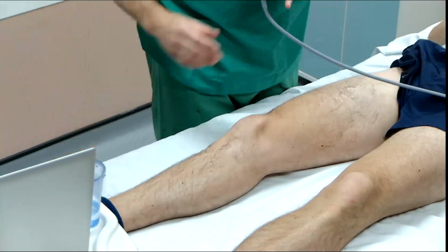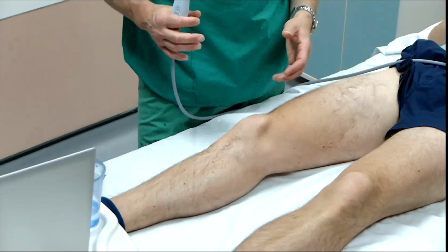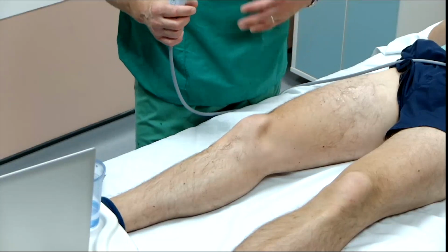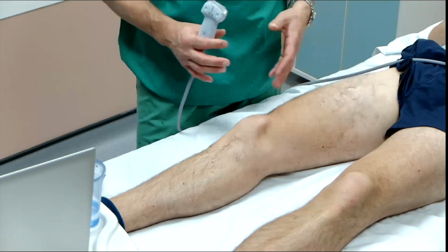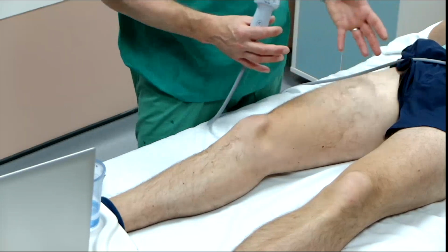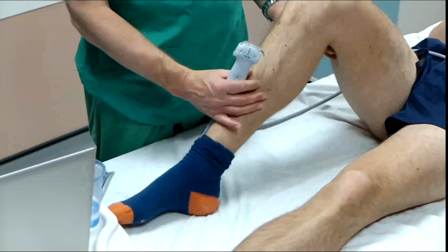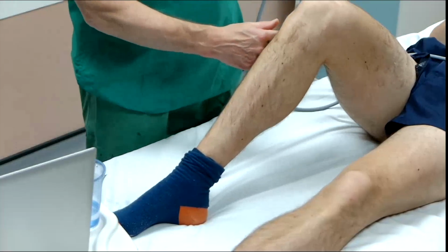For an iPACK block, I'm going to show you there are a couple of approaches. I'm going to show you the lateral approach, which I think is easiest, because if you're familiar with doing a popliteal sciatic nerve block, you're familiar with the orientation. You're still stood on the same side of the patient you've been to do your femoral triangle block. So we're just going to bend Max's leg up like this, and we're using a curvilinear probe here.